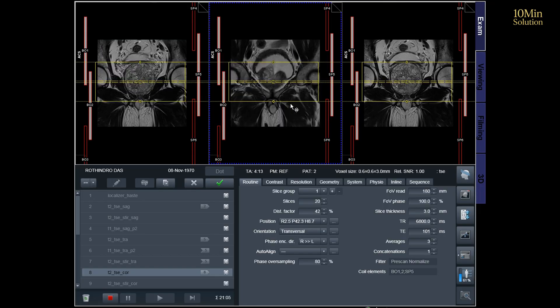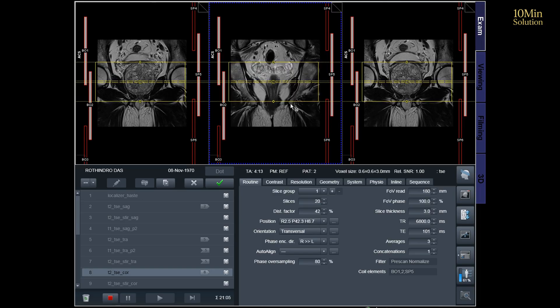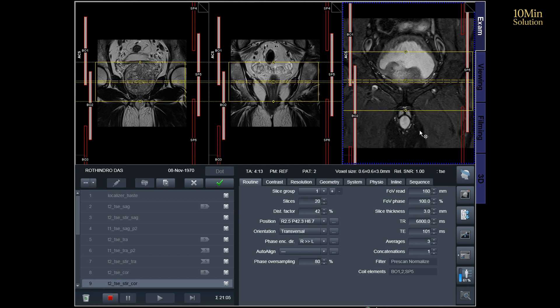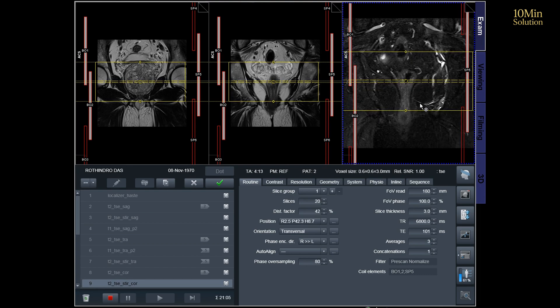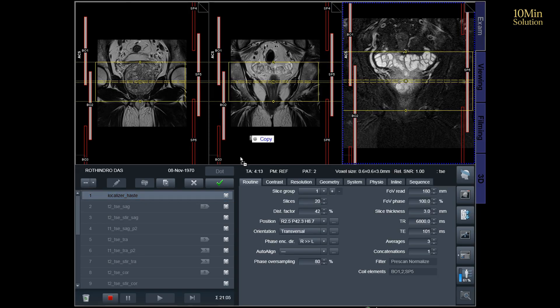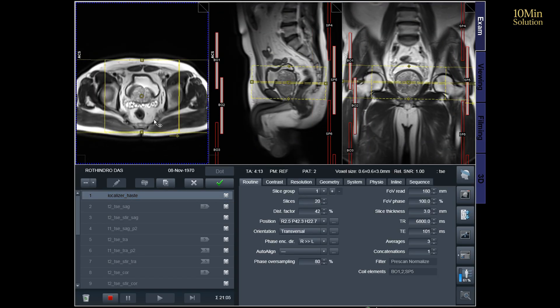Slices must be sufficient to cover the whole prostate and seminal vesicles. Additionally, to minimize artifacts arising from arterial pulsation, peristalsis, and breathing, consider incorporating saturation bands on top and in front of the axial block.